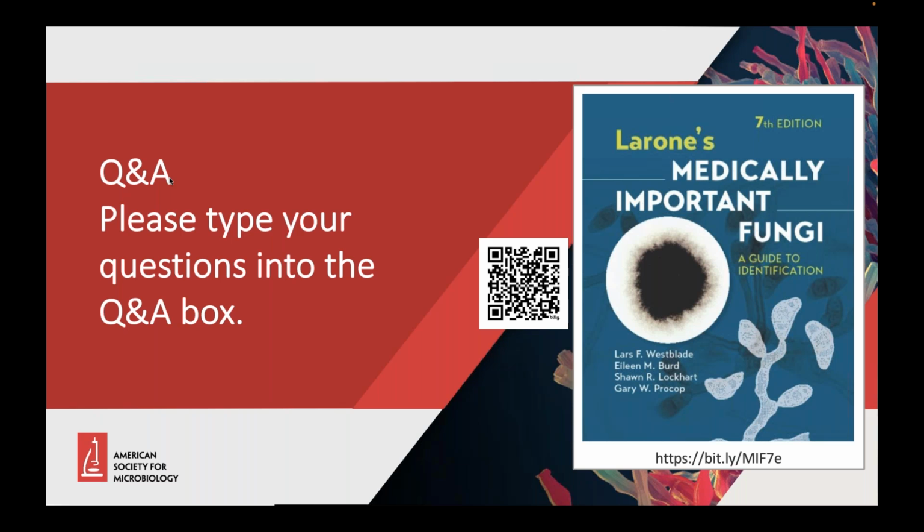So for the biochemical aficionados like myself, and clearly this person, I think there's still going to be some room for biochemicals, probably just not as much as we've leaned on before, and that's also a blessing, right? Because it's basically freed up labs in this kind of resource limiting world, in both staffing and reagents, so that we can lean on MALDI and do away with a lot of the biochemicals.